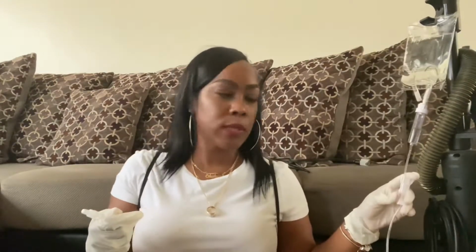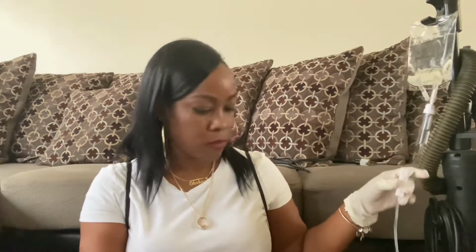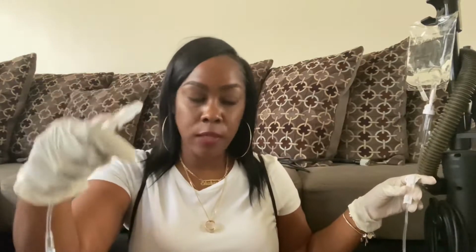So what I'm going to do is unroll it just to make sure that I prime the tubing. And then see, it's dripping out a little bit like that. Of course, I would be over a sink or something. I closed that right there after I did the chamber. And then after I did that, what is next? I labeled it, made sure there were no bubbles. I hung it above the patient.